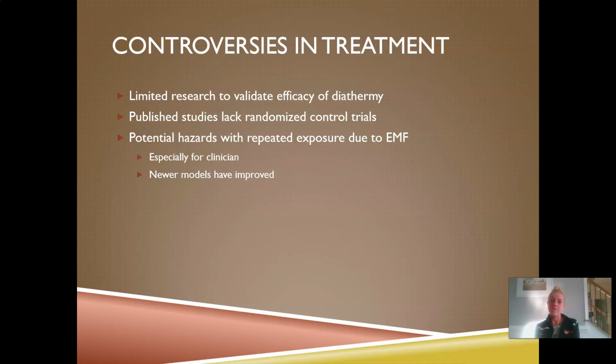Also, some of the controversies center around those potential hazards with repeated exposure to electromagnetic frequencies, especially for the clinicians who are, again, going to be exposed potentially multiple times throughout the day. Again, with the newer models that we're using now, they have made a lot of improvements to increase safety for both the clinician and the patient.